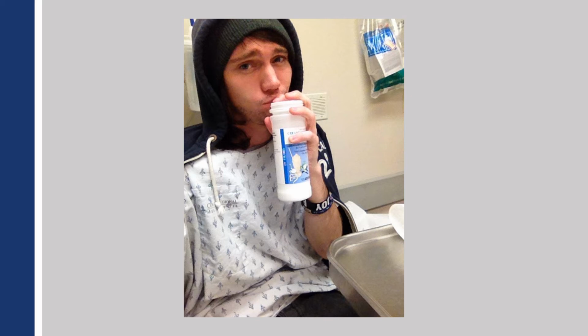So no matter how high-tech we get, there are times when we keep coming back to old standbys, and this is a technique that we've used for decades, and that is to have the patient ingest or to infuse barium into the patient and take radiographs with barium in the patient. You can see that this guy is really enjoying his meal of barium. That's kind of a typical appearance.